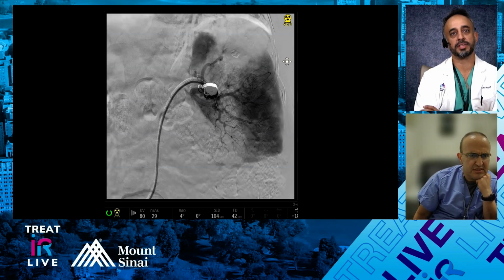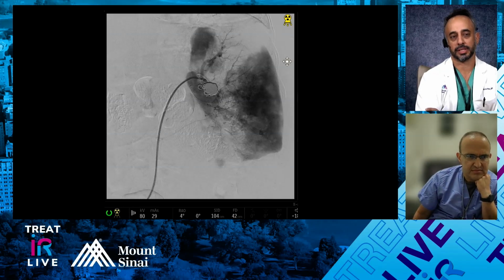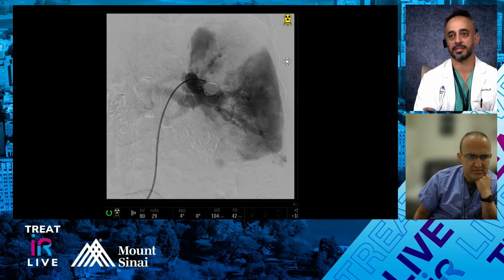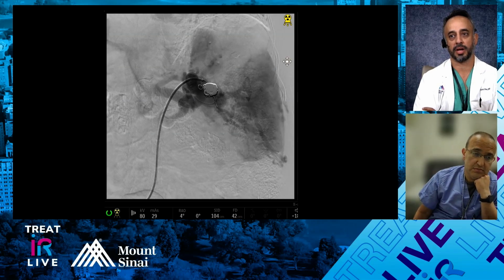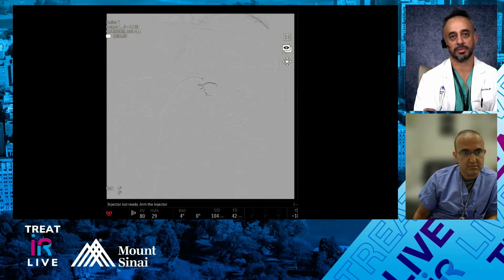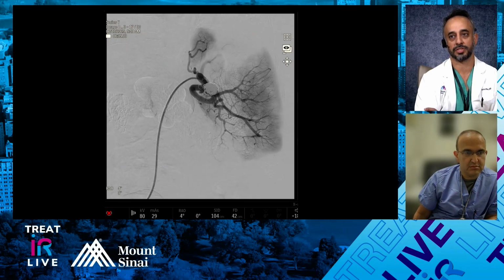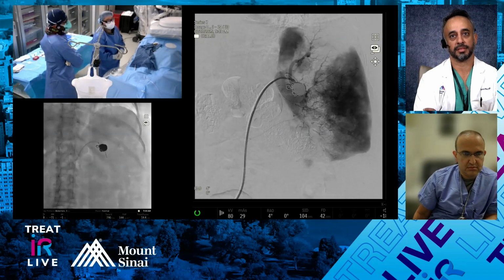When we do renal aneurysms, depending on how the setup is. We did a case recently where we used a carotid stent as a stent assist, and that one we heparinized just because we had such a big system across. We're not checking ACTs, but at the beginning when we're putting out the stent, we heparinize a little bit so we don't get clot going distal. But typically, no. It's sort of a one-off.